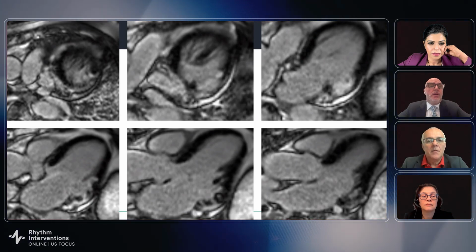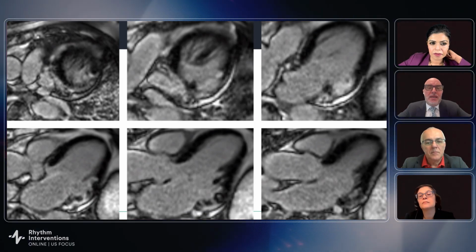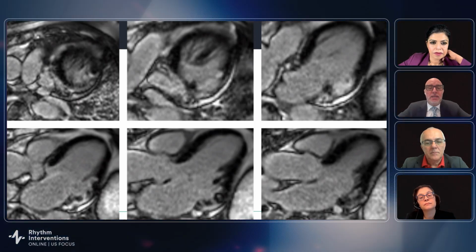And then here you can see the MRI. So this is the MRI after the case. And you can see a whole area here of a scar, essentially.